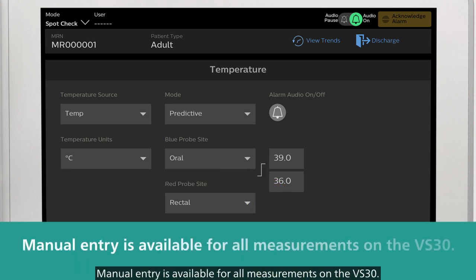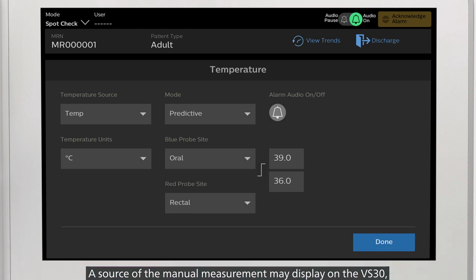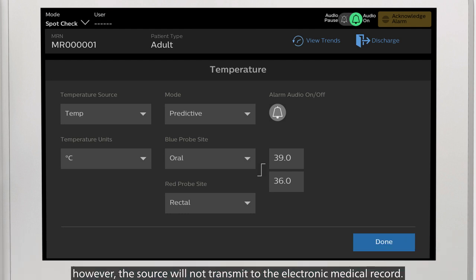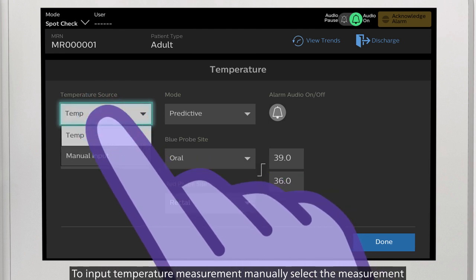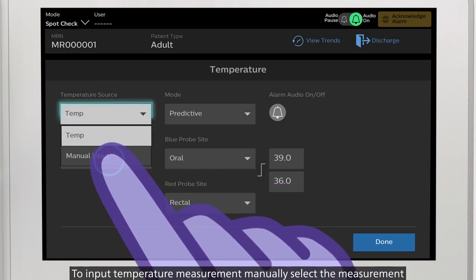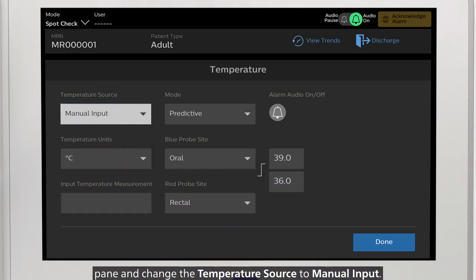Manual entry is available for all measurements on the VS-30. A source of the manual measurement may display on the VS-30; however, the source will not transmit to the electronic medical record. To input a temperature measurement manually, select the measurement pane and change the temperature source to manual input.